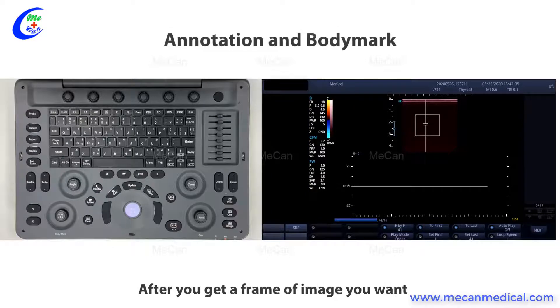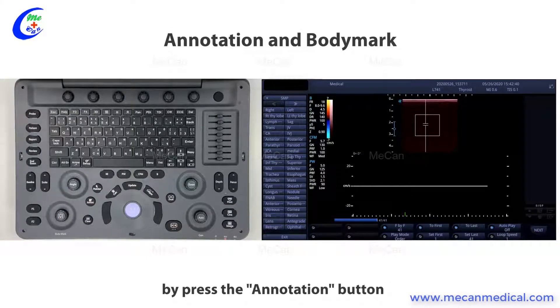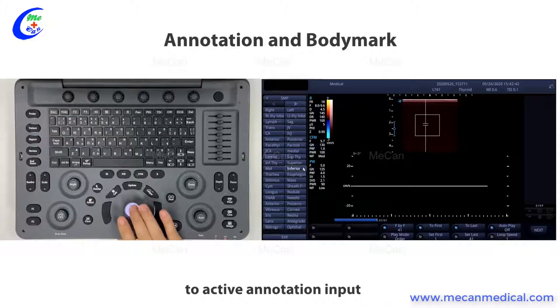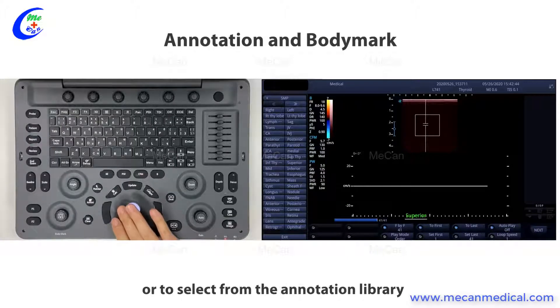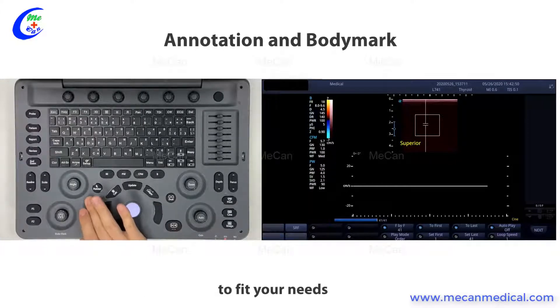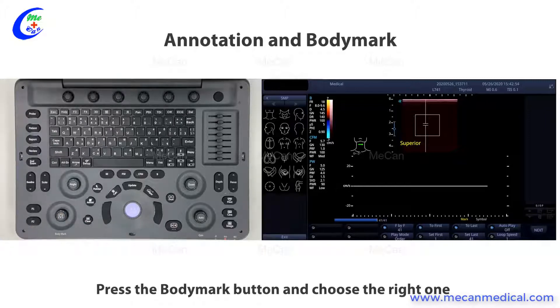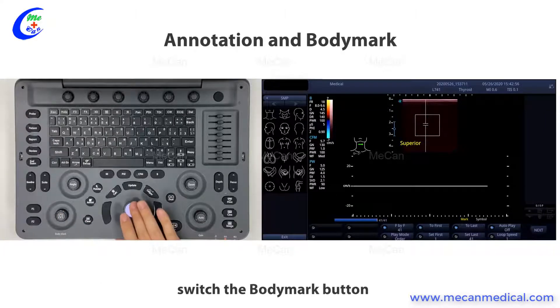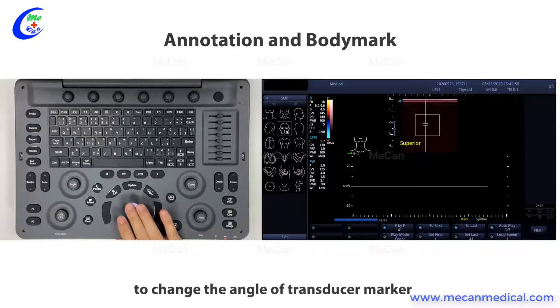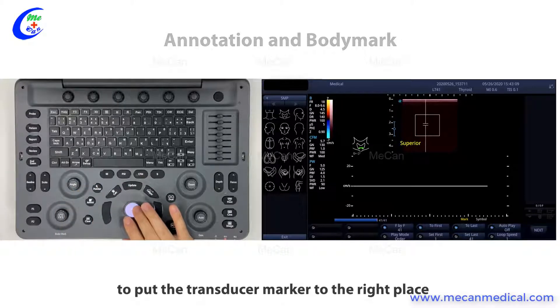After you get a frame of the image you want, you can add a comment by pressing the annotation button to activate annotation input or select from the annotation library. You can also select the right application to fit your needs. Press the body mark button and choose the appropriate one. Switch the body mark button to change the angle of the transducer marker, and move the trackball to place the transducer marker in the right position.